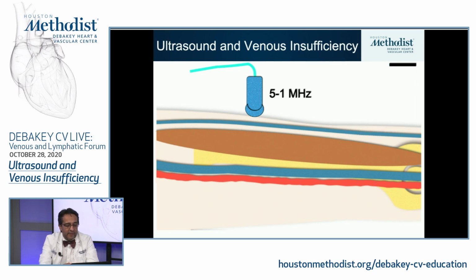So what happens when you let this go further is that you are going to have a better reflection and a better image.